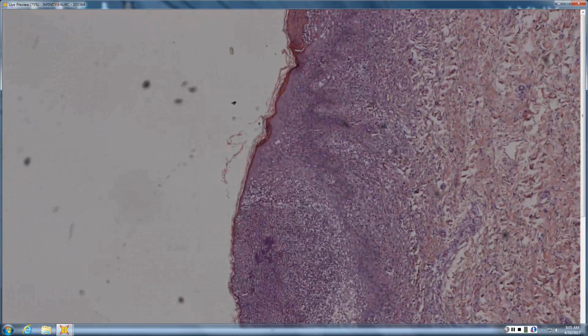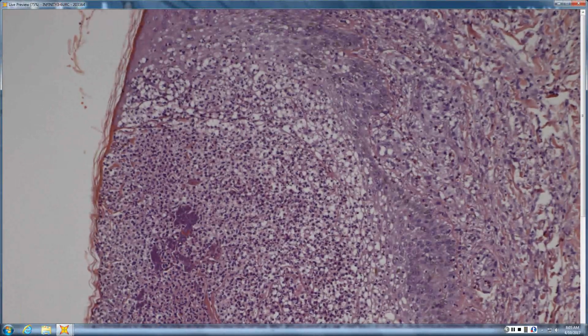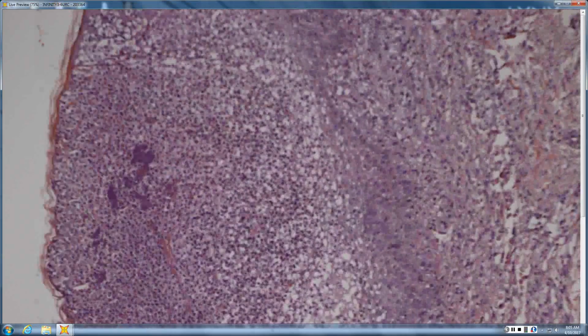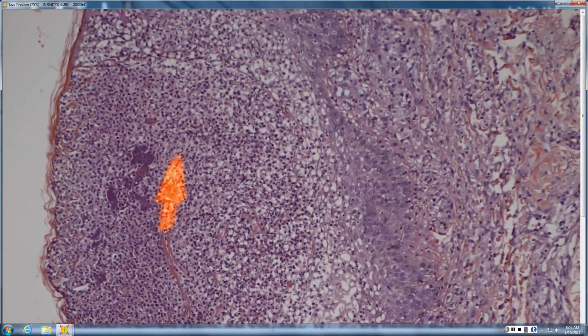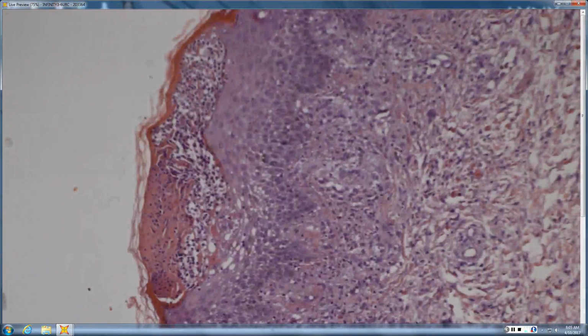So that looks like neutrophils in the left shoulder. Yeah, and anything within it? Yeah, maybe some bacteria there. Yeah, so some cocci, some staph. So probably some sort of abscess, or not necessarily abscess. Yeah, and it's sitting right up subcorneal. So probably impetigo, with all that staph there. The history says AGEP. If that's AGEP, it's secondarily impetiginized because there are big staph colonies there.